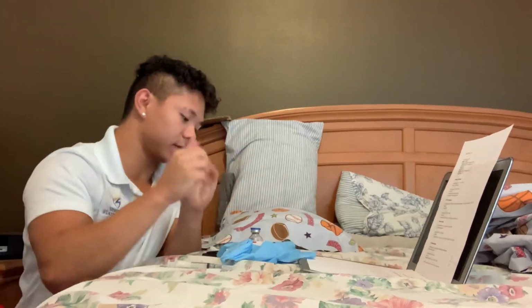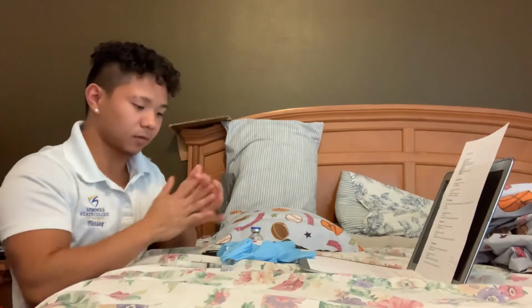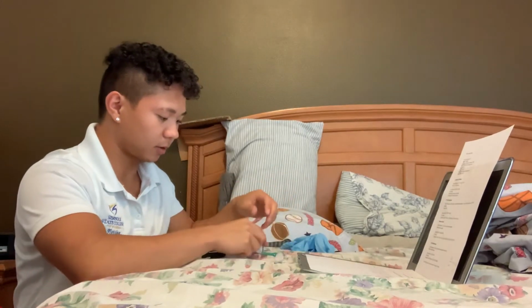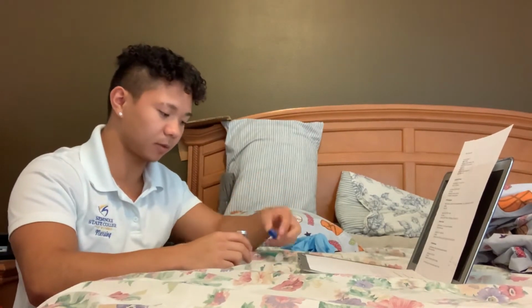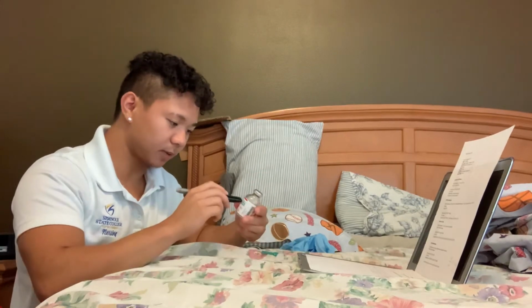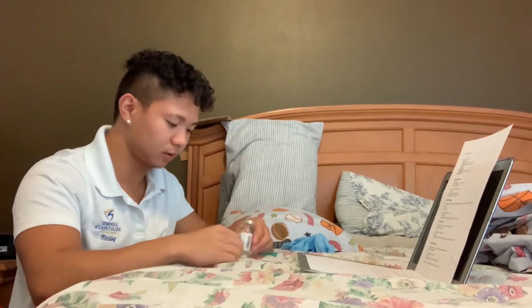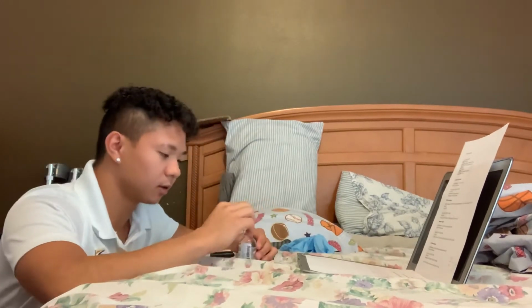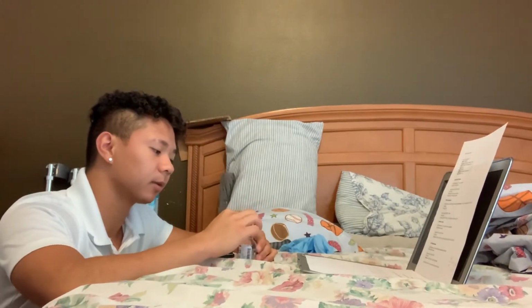So you can see, I'm going to remove the cap. I'm going to time, date, and initial. And I'm going to use a clean alcohol pad, a brand new one, to clean the rubber stopper.